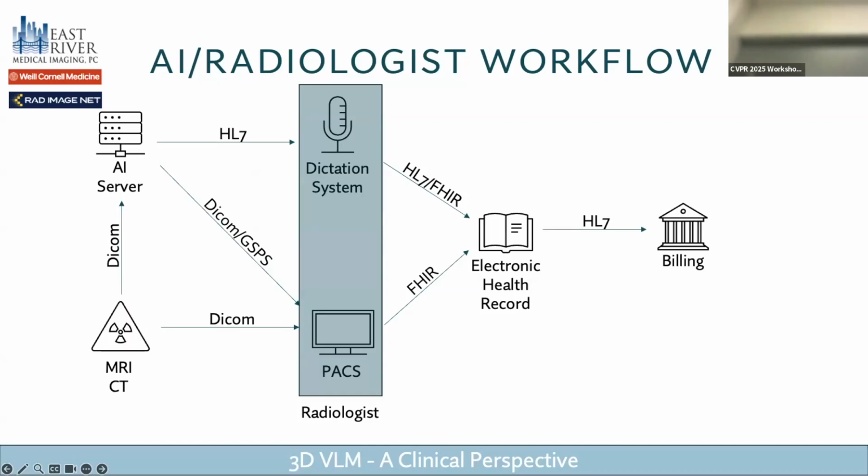This is a proven workflow, by the way. If we replace AI server with radiology resident, it's the same thing, right? This is what people are used to doing in an academic setting. So this has very little disruption to the radiologist, but potentially makes them much more efficient.